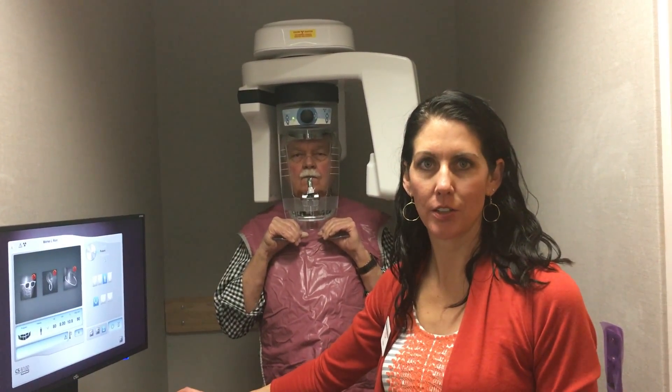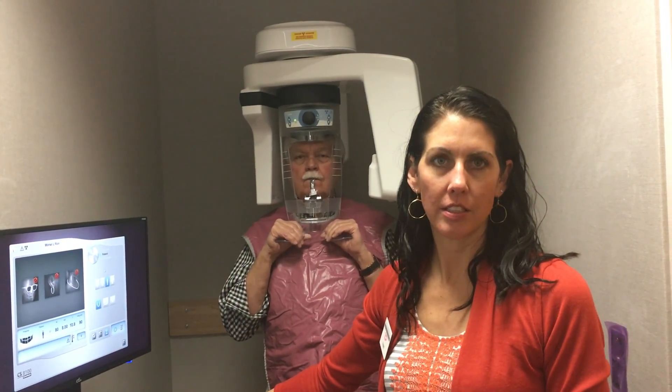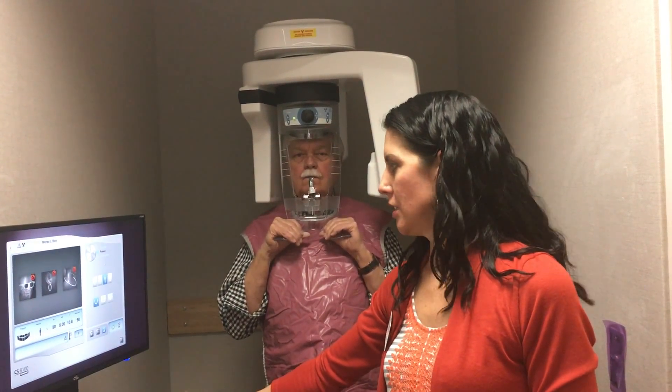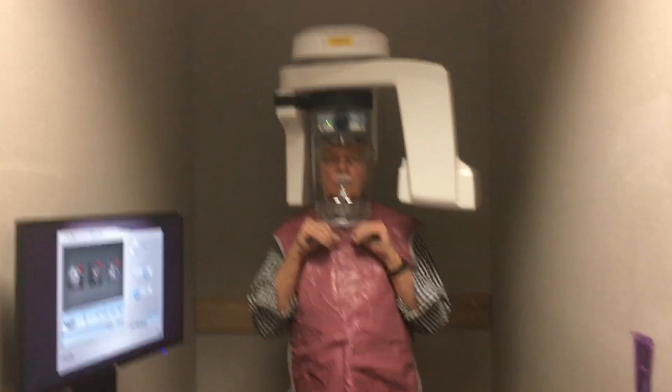I'm one of the hygienists here at Dr. Morse's office. We're going to take a pano with our state-of-the-art digital pano machine. So let's try that again and just try to shorten your shoulders a little bit.